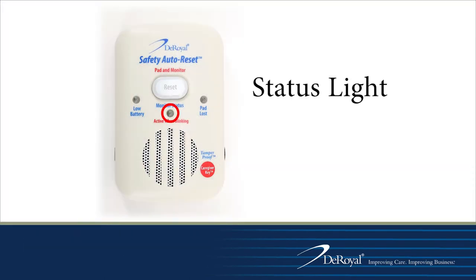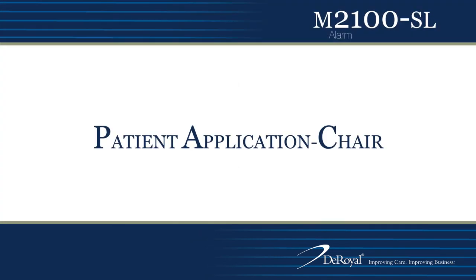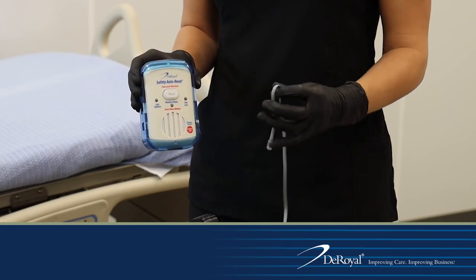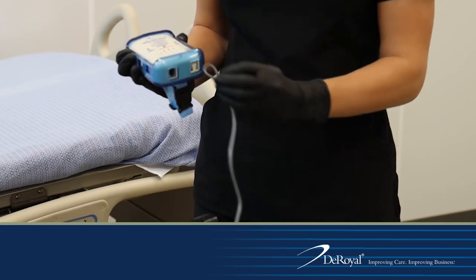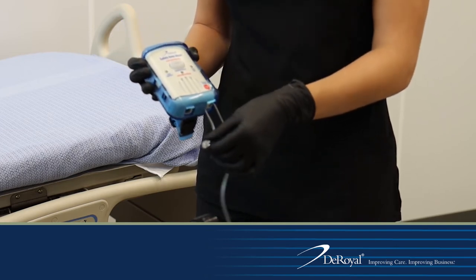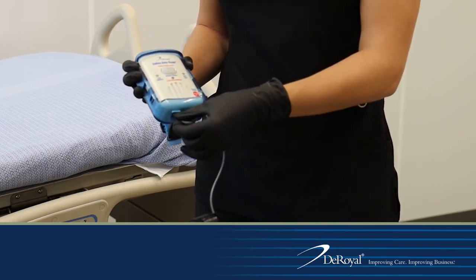When the monitor is turned on and the patient is on the sensor pad, the monitor status light will flash every four seconds to let staff know that the monitor is in use. When connecting the sensor pad cord to the monitor, pinch the cord together and route it through the strain relief recess on the fall monitor. Insert the plug into the plug input located on the bottom of the monitor.